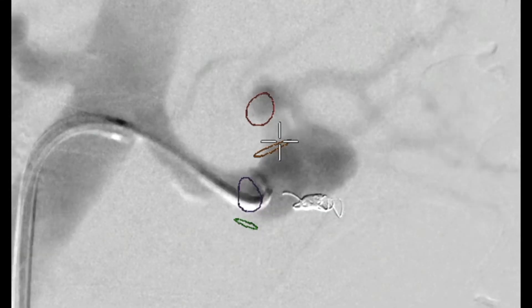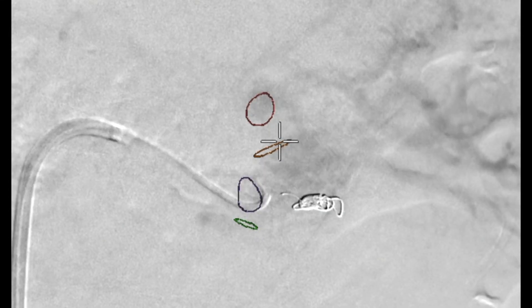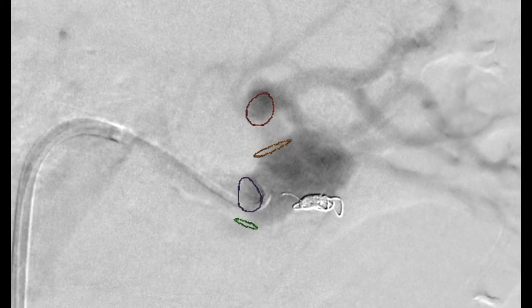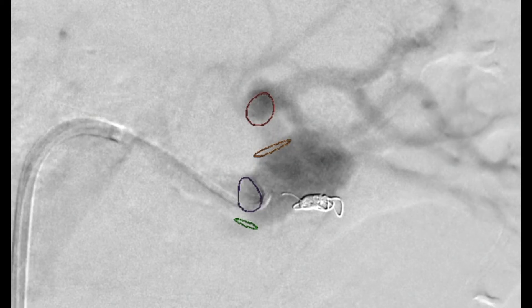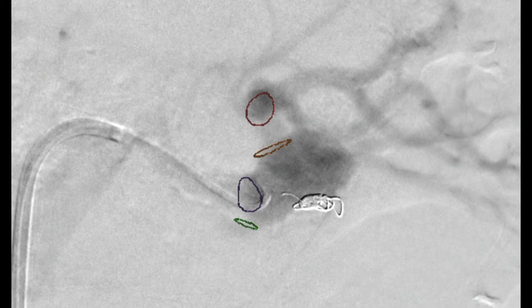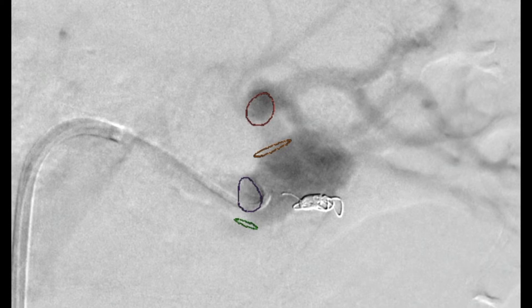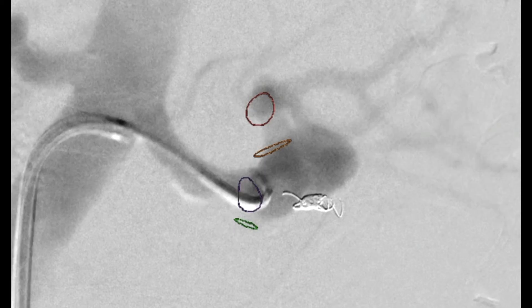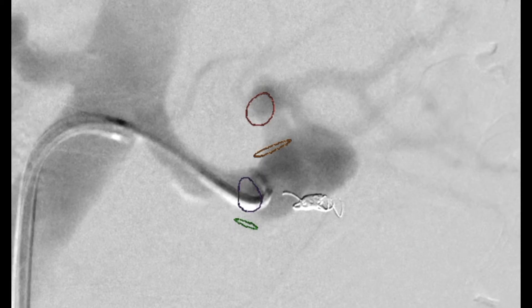Shown here are the marks obtained secondary to the dynamic CTA performed earlier. The orange mark demonstrates outflow through the aneurysm sac, and the red mark demonstrates where this outflow branch divides into two and supplies the upper two-thirds of the kidney. The green mark demonstrates the lower renal pole branch that has been coil embolized, and the purple mark demonstrates the main inflow vessel into the aneurysm sac.